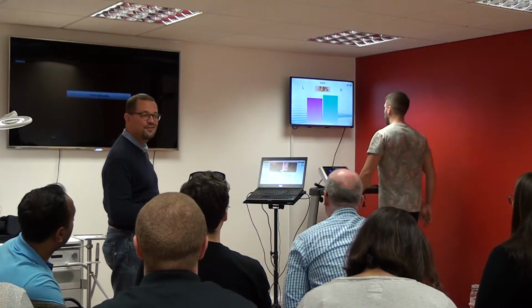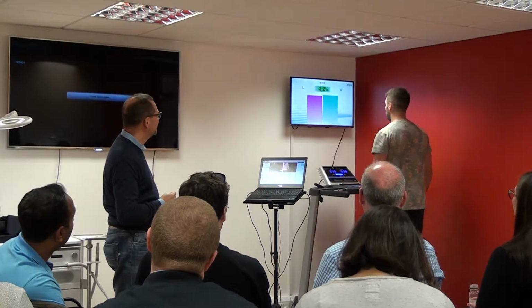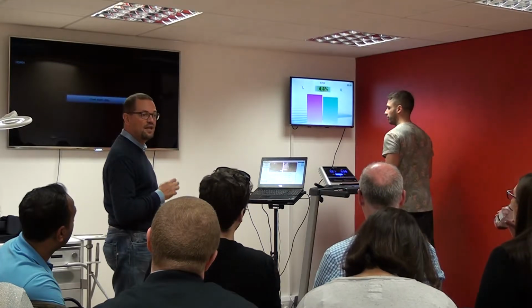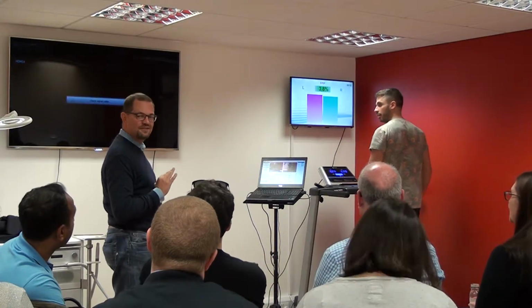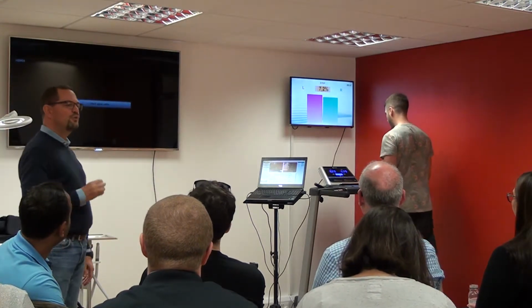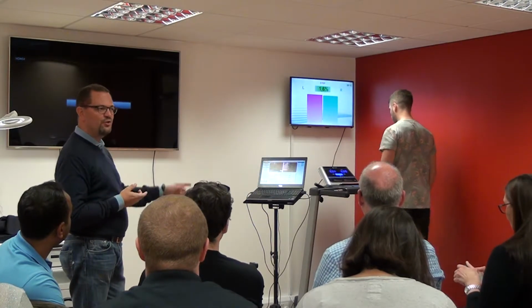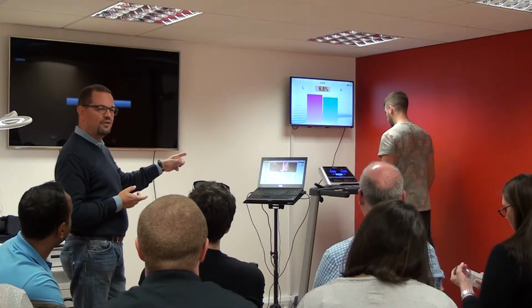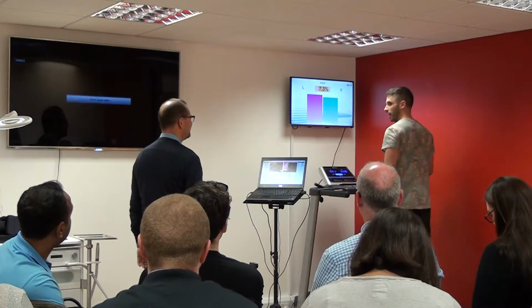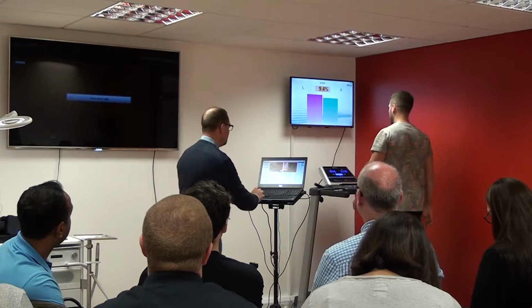But more difficult. Yeah. More difficult. Completely balanced. More difficult. Got to adjust. This is very difficult. If you need to adjust, it's not easy. No? But what are we doing? We're doing neuromuscular reactivation and training. You do 10 minutes, 15 minutes in this way, you're dead. You have to rethink how I'm walking again to see what's a little bit more similar.